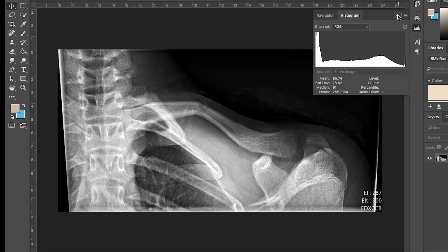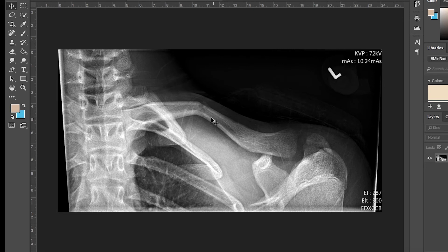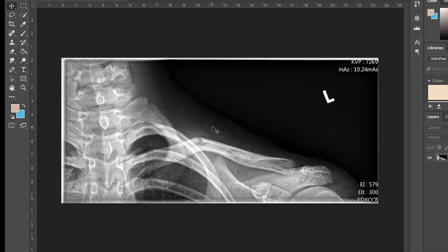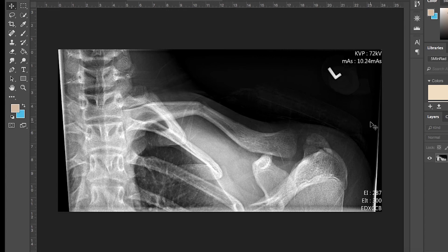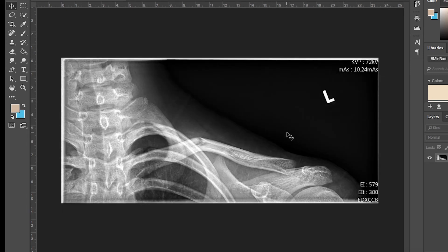Same technical factors were used. The average value is lighter because you're centered appropriately — the central ray goes right through the clavicle on this image. You can tell this is the axial shot just because of the shape of the collimated field being angled at the periphery. If we had done the same technical factors on the first image and centered a little bit higher, we probably would have gotten an EI closer to 300. A 10-degree cephalic angle might influence your SID by half an inch or so, but really not that much, so you're maintaining consistency with SID. The only difference is the collimated field. To fix this, we need to make sure we're centering appropriately each and every time, maintain consistency, and you'll be able to more accurately predict the exposure indicator based on the technical factors you know work.